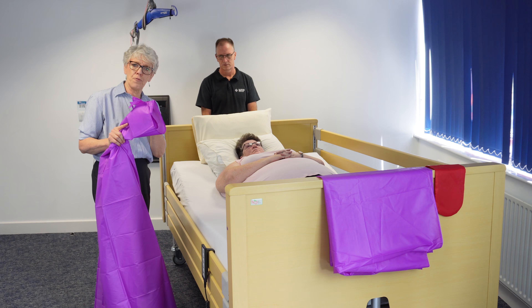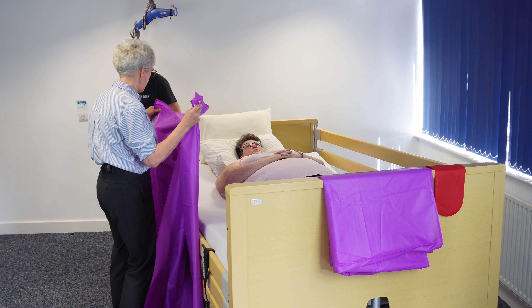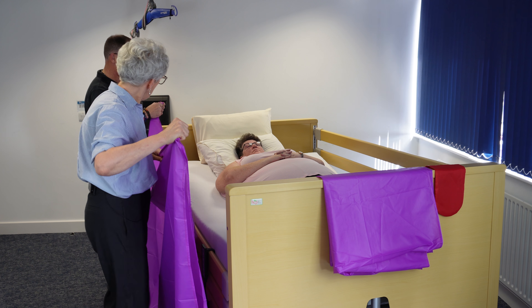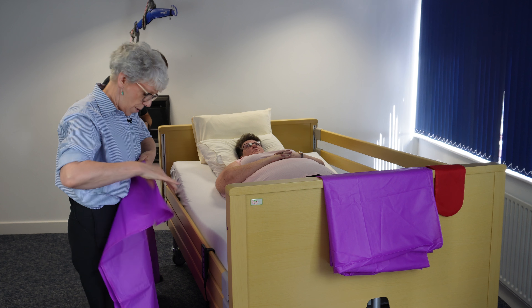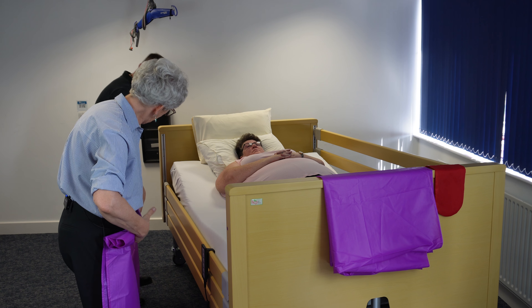So we're going to start off by rolling our slide sheets — I'm going to ask Chris to give me a hand here. Using two slide sheets together, we roll them together about halfway, so about there.